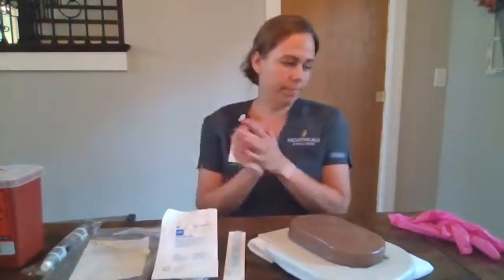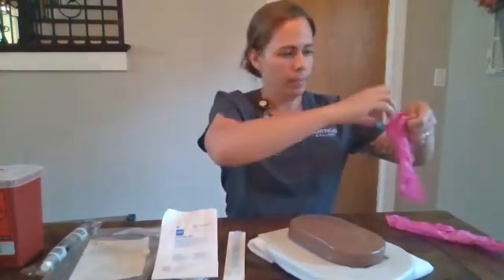Hi, I'm Kimberly Treon and I'm going to insert and discontinue a peripheral IV. I'm going to start by doing my hand hygiene and place my gloves.